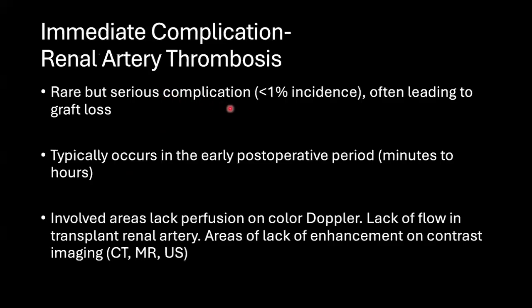Renal artery thrombosis is serious, but it's very rare. Over the last 3 years in SQH, since I returned from fellowship, I've seen 2 cases. So not as common as the other diagnoses. It typically occurs early post-op. So the patient is just out of the operation, or even sometimes they call us for intra-op ultrasound, and we see that the artery is already thrombosed. There will be lack of perfusion if it's regional, for example, one segment of the artery or the kidney, or lack of flow in the whole artery.